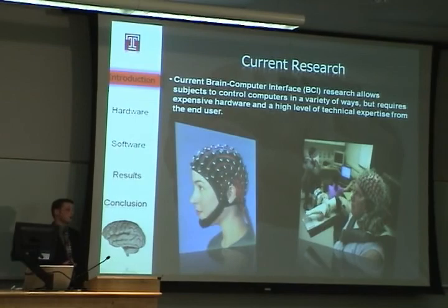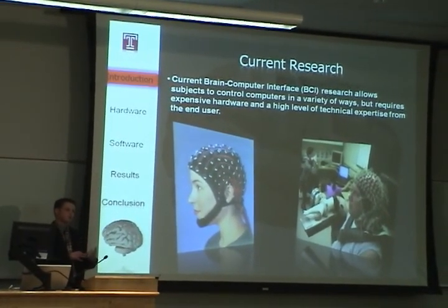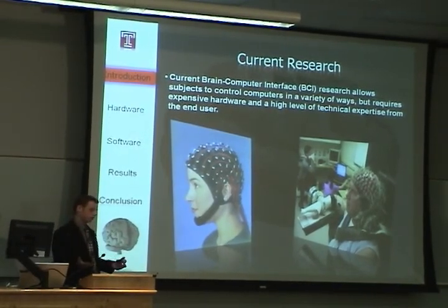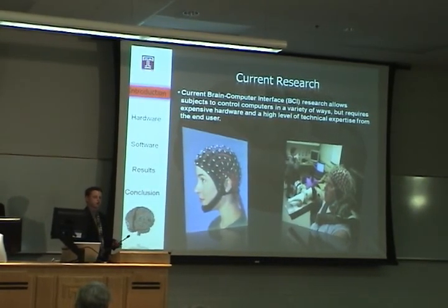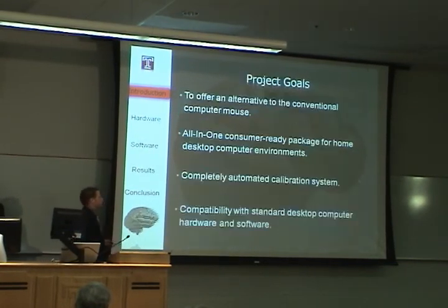What they're doing now with current brain-computer interface is correlating these signals, like I said, to elementary brain functions and using it to control prosthetic limbs for the physically disabled, and even to control mouse movements, for example, which is the primary interest of our project, to use brain signals to actually control the mouse cursor on a computer.